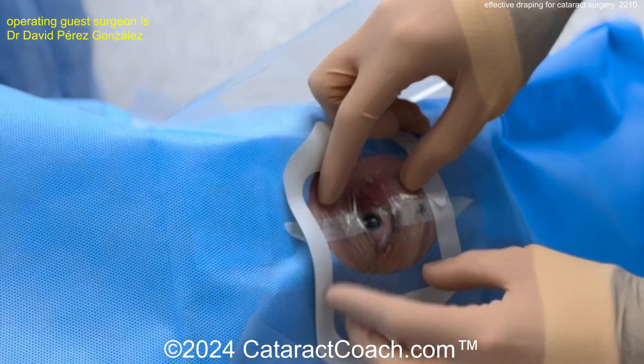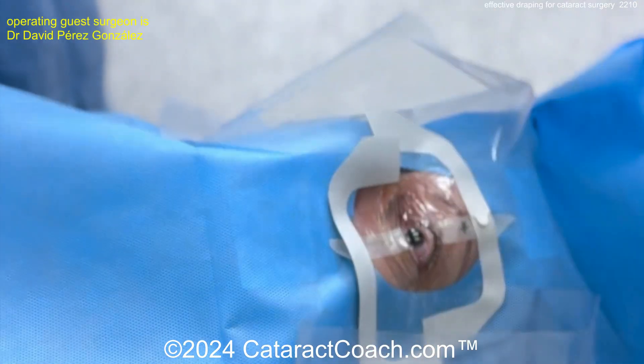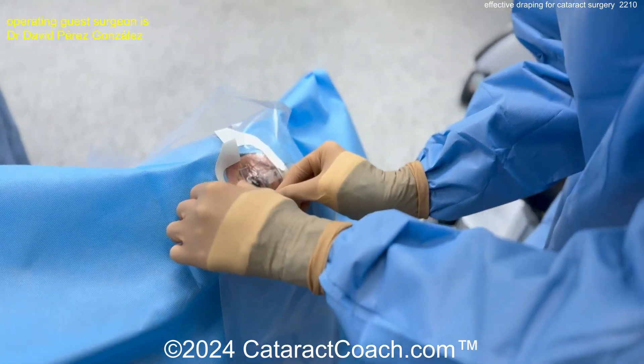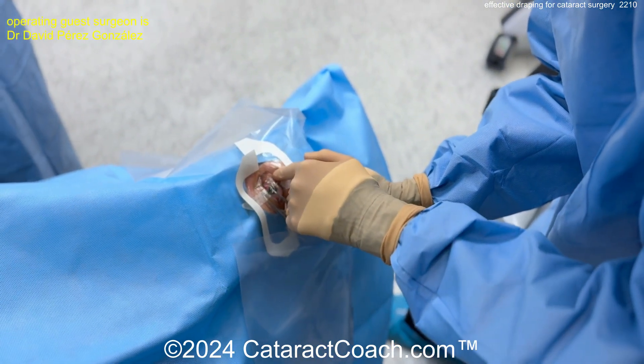Here's the Tegaderm again being placed. Notice the entire time the surgeon does not touch the eyelid skin. Now just place your speculum. I like to place a little BSS squirt on the eye just to make sure you don't get a corneal abrasion. Speculum is being placed and that looks great.